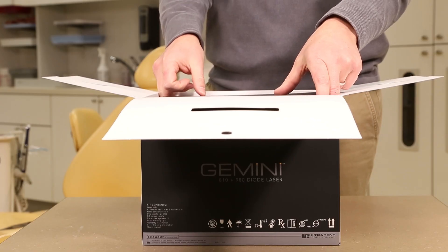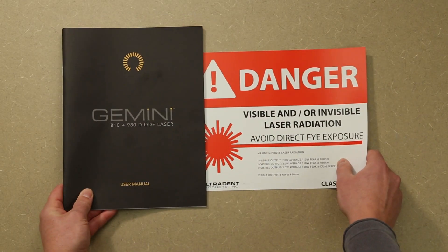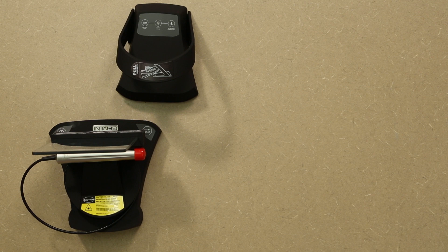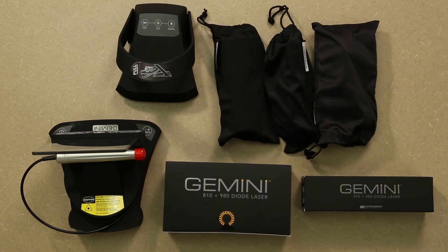As you unpack, make certain you have all the contents necessary for operation. Inside the box, you will find the warranty card, instructions for use, training voucher, laser unit and handpiece, foot pedal, three sets of protective eyewear, power supply and tips.